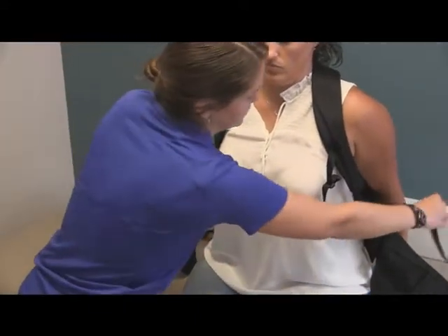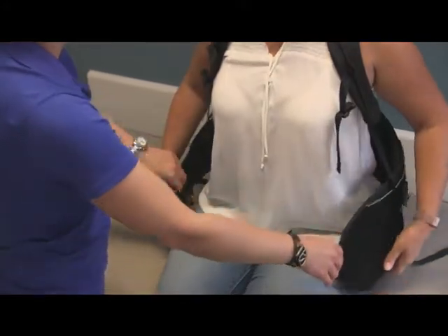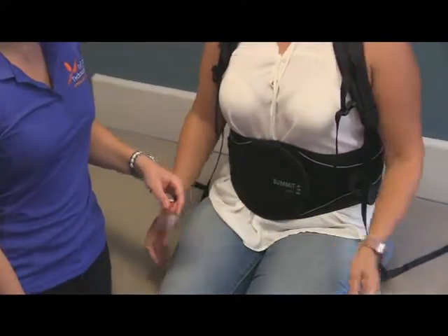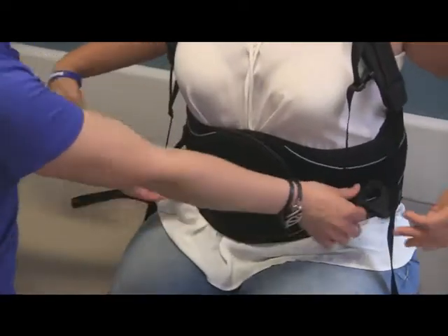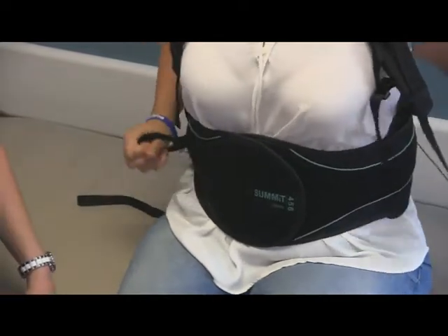If the patient is doing it themselves, they're going to be able to grab the waist belt and overlap it in front of their body. The rough portion of the Velcro on the right side is going to overlap on the soft portion of the Velcro on the left side. Get it as snug as you can, but it doesn't need to be too tight, because then you're going to grab the rubber straps on either side, unhook those, and pull them equally across the front of your body.